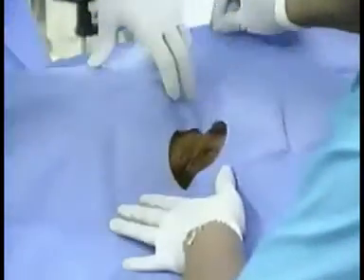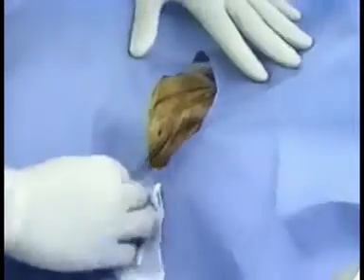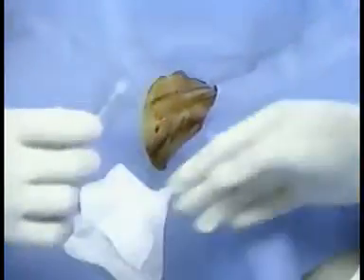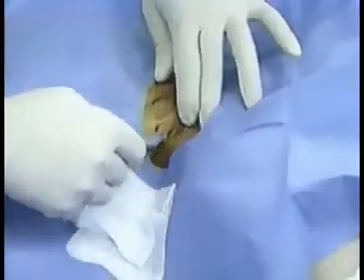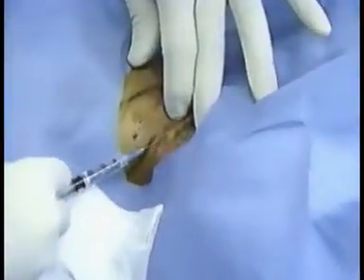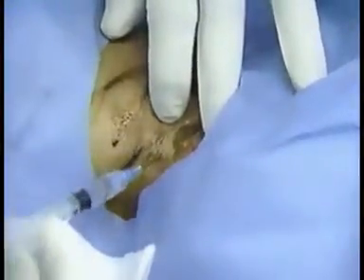After the betadine has dried, apply the sterile drape with the opening over the insertion point. Place sterile gauze adjacent to the opening in order to wipe up any blood from the needle stick. Palpate the posterior head of the sternocleidomastoid muscle and inject a superficial wheal of lidocaine. Then inject lidocaine more deeply along the path you plan to follow with the introducer needle.